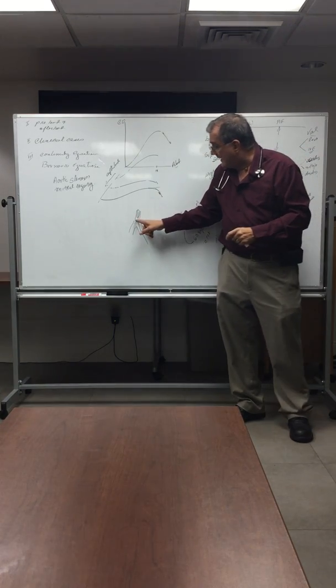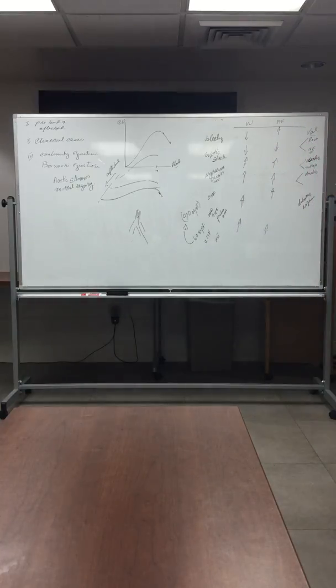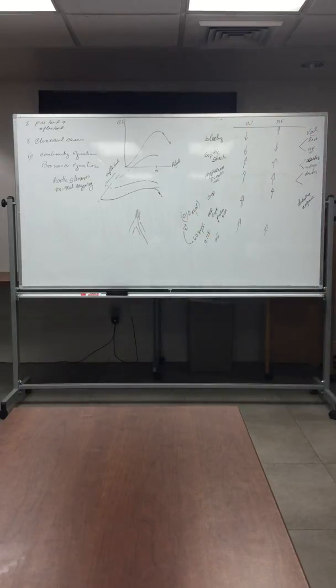When it inflates again, now it displaces blood and pushes blood down and up into the other organs. So essentially, it's a ventricular assist device where you are assisting the ventricle to beat in systole by reducing the afterload, and then when the aortic valve closes, it expands again to push blood into the periphery, into the other main organs. The only contraindication is severe aortic insufficiency, because then you're going to leak back into the ventricle when it expands, and you can essentially wipe the ventricle out.